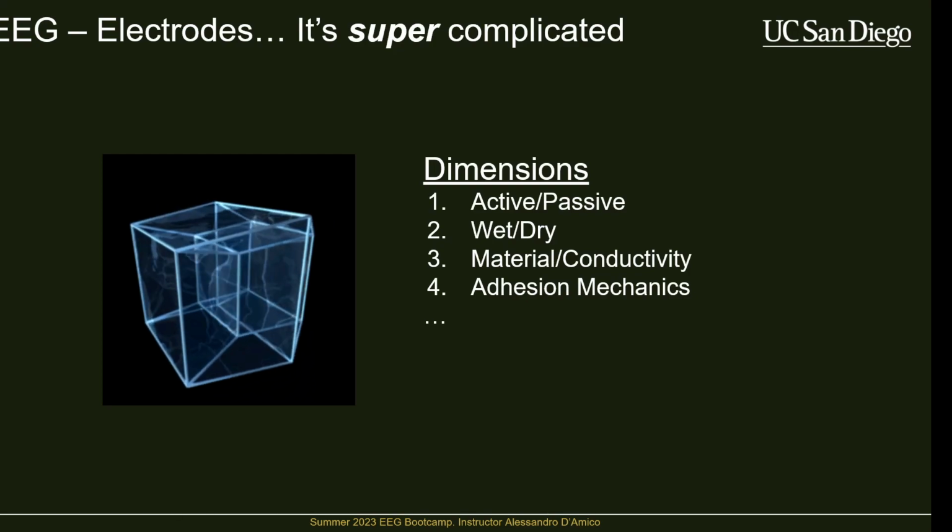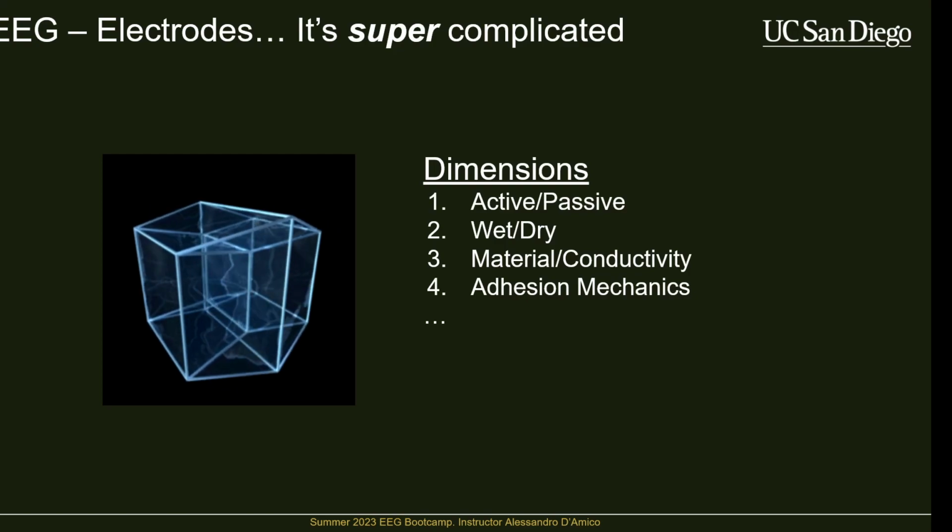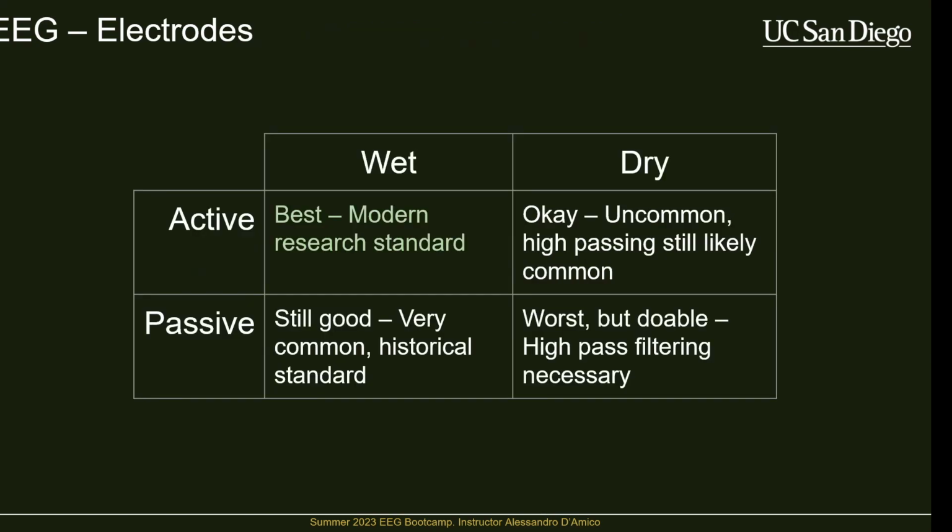Yeah. So is the wet active kind of like the most, has the most credibility? Totally, yeah. So I would say, without doing my own data harvesting, just from the papers that I've read, anything within the 2000s and onwards when EEG really started to explode, almost all of those papers are using wet active electrodes.